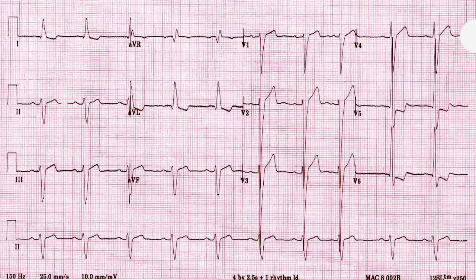Okay, so as you can see here, you see ST elevation in V2, V3, and then you see some ST depression in V6 and in the other lateral leads, and you might be thinking, oh, I've got an anteroseptal STEMI, especially if the patient was presenting with chest pain, which these patients clearly will because they often have prior cardiac history. This is normal. That ST elevation is normal. These QRS complexes are very deep, and that's clinically insignificant ST elevation.